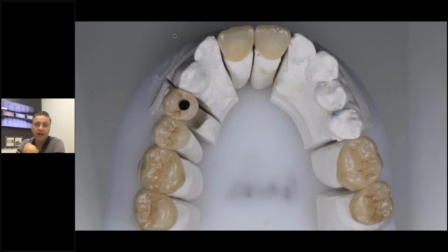You see here in the anterior crowns, unfortunately, they're not very detailed, and usually I like to do more anatomy in the lingual. I chose this case to show you that I was not happy about the case, but I also could not do anything else because the patient and the doctor requested a very smooth and non-playful lingual anatomy, so literally no anatomy. So I personally don't like that. I think there is a need for anatomy lingually, to give your lingual a little bit of love. Yeah, sometimes we just have to follow instructions from our customers.